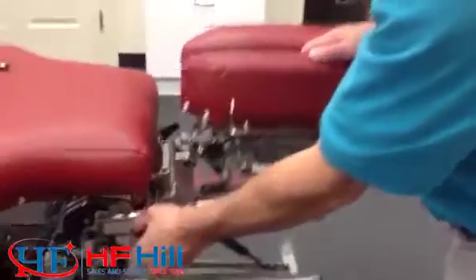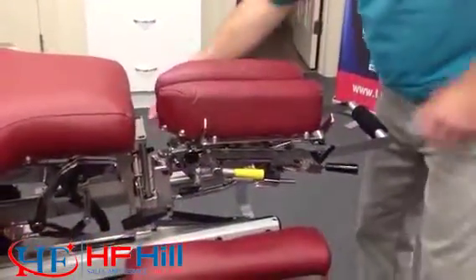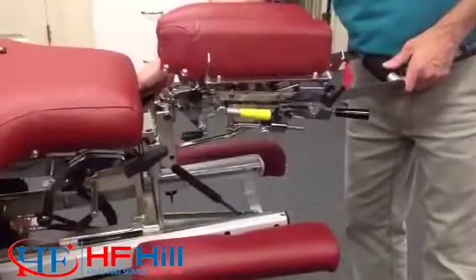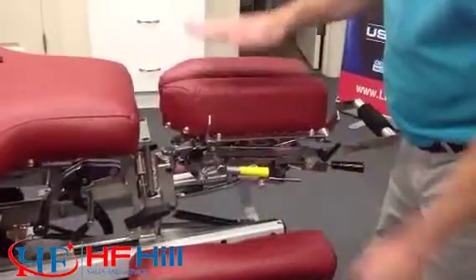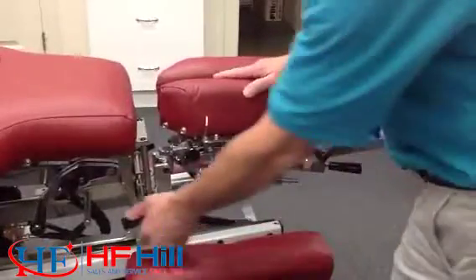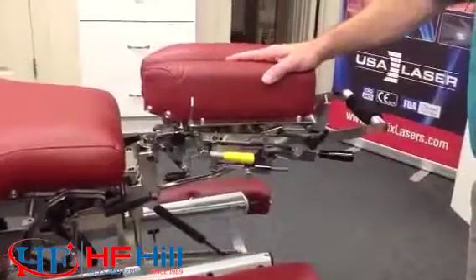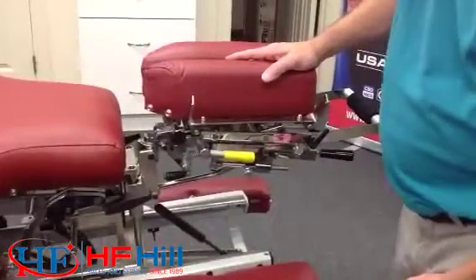Okay, so we start with the elevation of the headpiece. It's a knob on either side, and you simply turn the knob and the headpiece goes up and down. It's got a 5-inch range to it. I'm going to leave it in the up position so that we can see as much of the mechanical workings under the headpiece as possible.